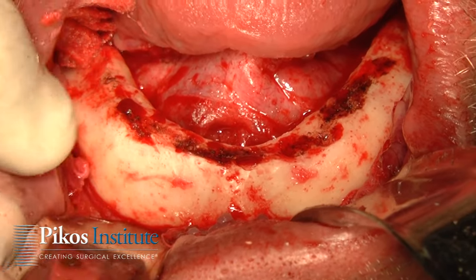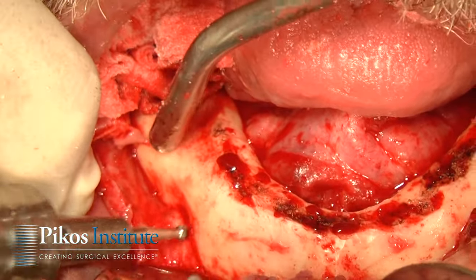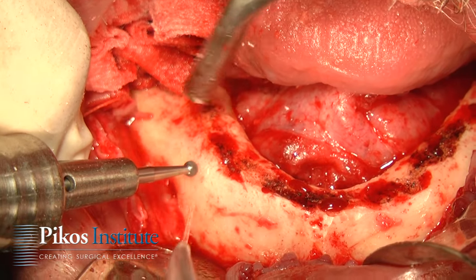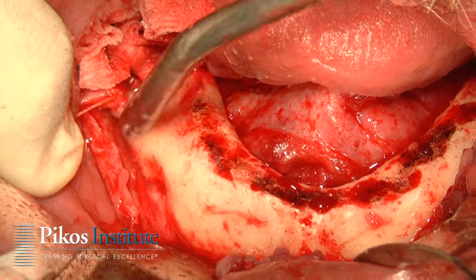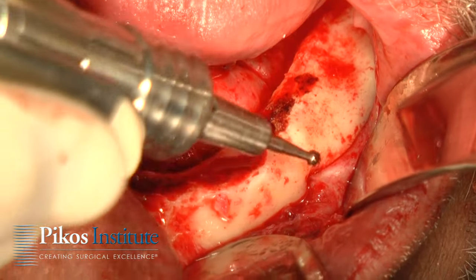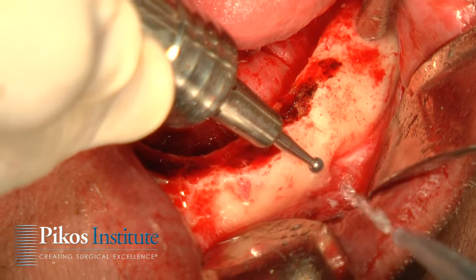We're going to mark our foramina. The way I do that — you see the nerve coming out, there's the anterior border of the foramen. So I'll just make a small little divot like that. We'll do the same thing on the left side. We can see exactly where that bundle is, there's the anterior extent of that foramen. So we'll mark that.